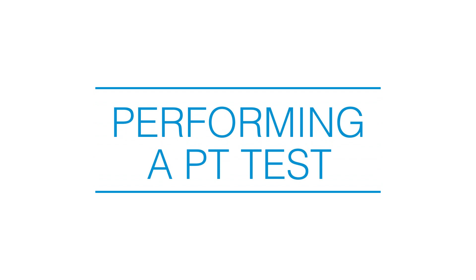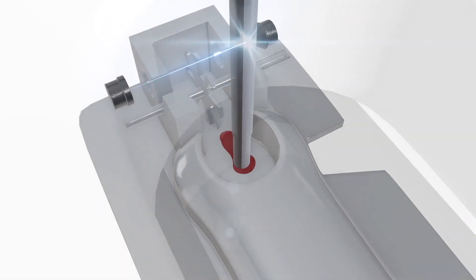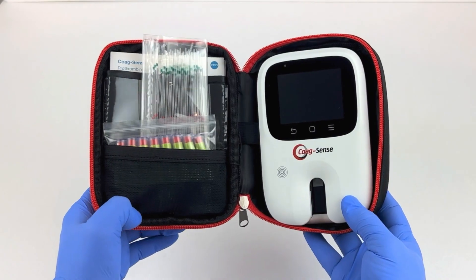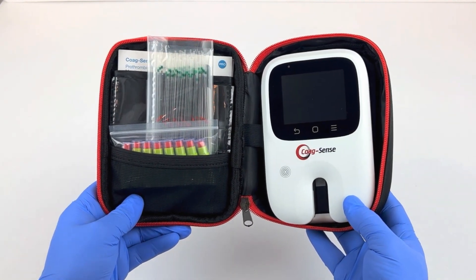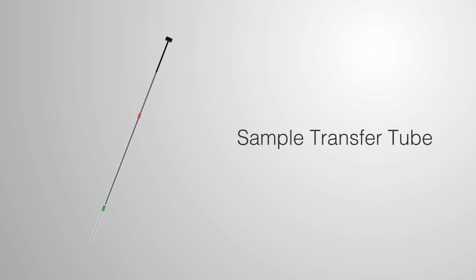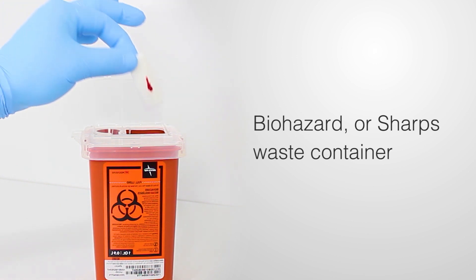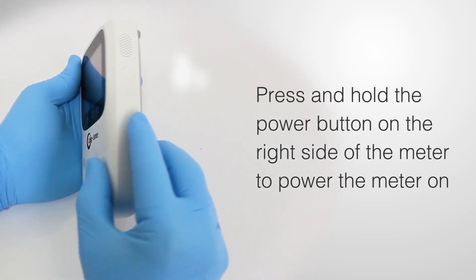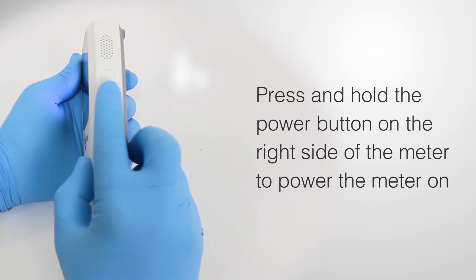This video provides a brief overview of how to perform a PT INR Test. Make sure that you have all the supplies needed before you start, including a 21-gauge lancet, sample transfer tubes, sterile alcohol prep pads, gauze square, and a biohazard or sharps waste container.